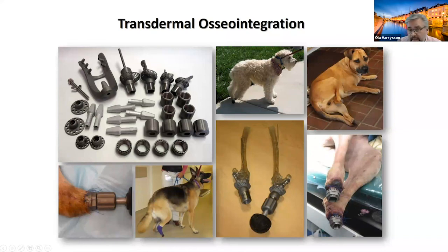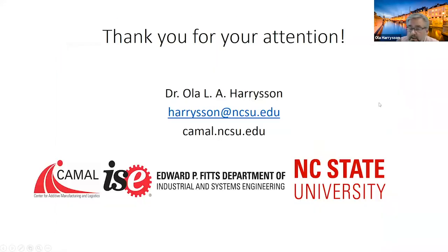And then, of course, we let it heal for about 4 to 6 weeks before we put the prosthetic feet in. And Jack went from not being able to ambulate at all to being able to run and jump and enjoy life.